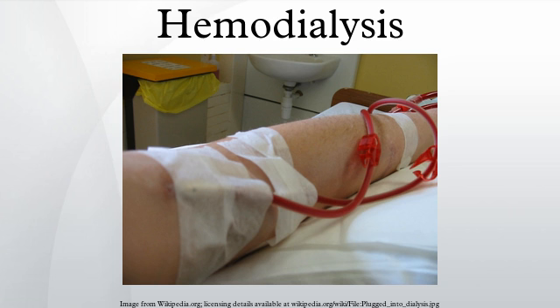Another group of membranes is made from synthetic materials, using polymers such as polyethersulfone, polyamide, polyvinylpyrrolidone, polycarbonate, and polyacrylonitrile. These synthetic membranes activate complement to a lesser degree than unsubstituted cellulose membranes. Synthetic membranes can be made in either low or high flux configuration, but most are high flux. Nanotechnology is being used in some of the most recent high-flux membranes to create a uniform pore size.